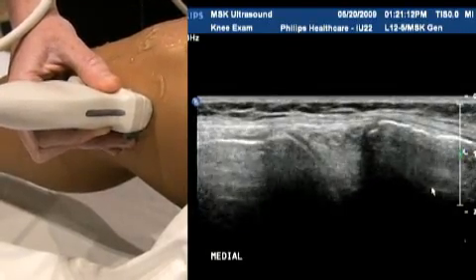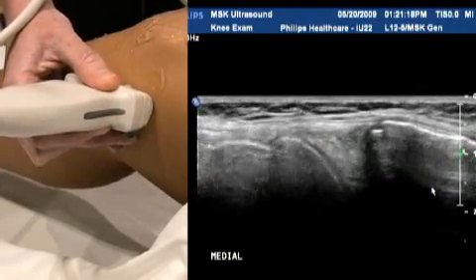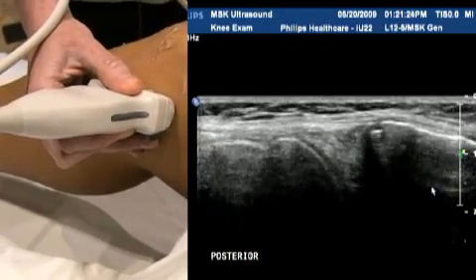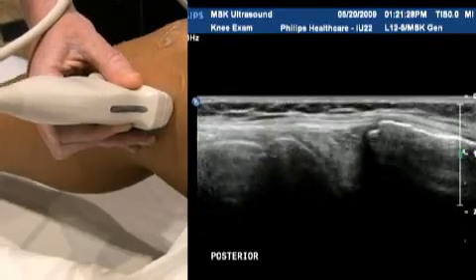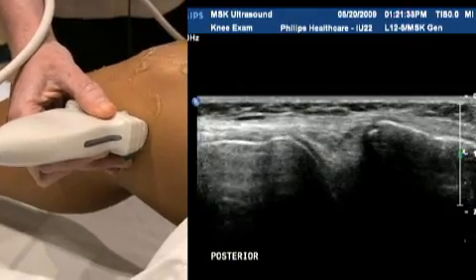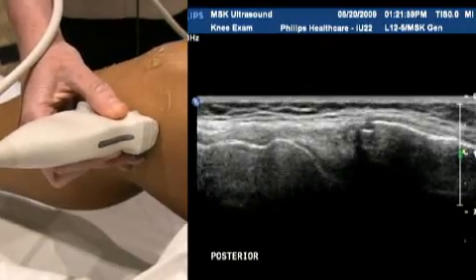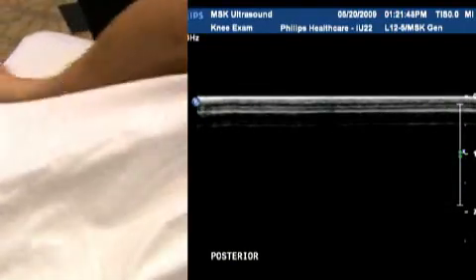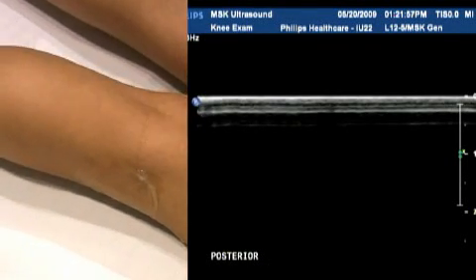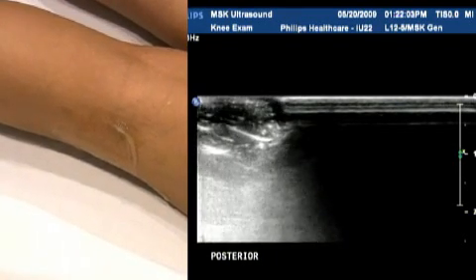Those are the major components we look for in the knee anteriorly. The other thing we can do, depending on patient symptoms and indications, is to look posteriorly in the knee. When people talk about musculoskeletal ultrasound one of the first things that comes to mind is a Baker's cyst, and that's something we're going to find posteriorly in the popliteal fossa. If the patient is difficult to move, it's fine to approach from the side, though you'll get a better overview if you can get the patient prone.